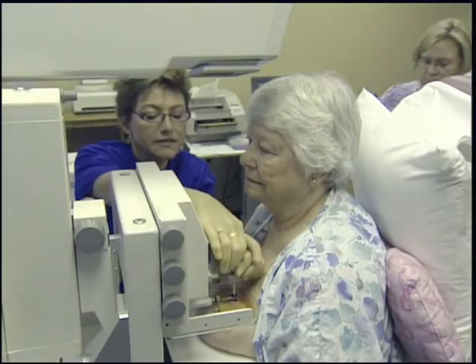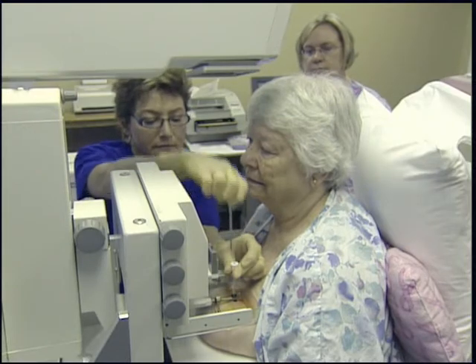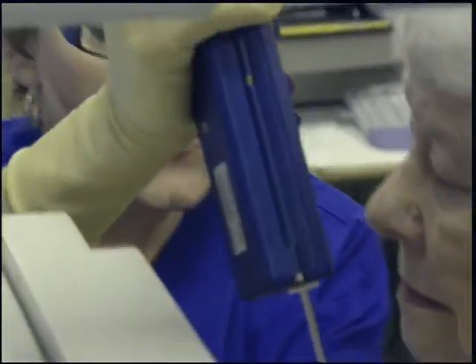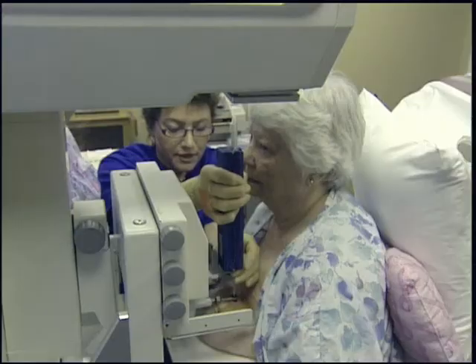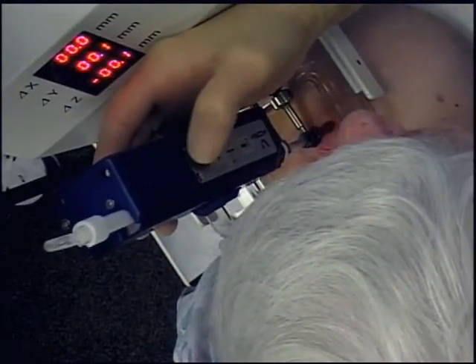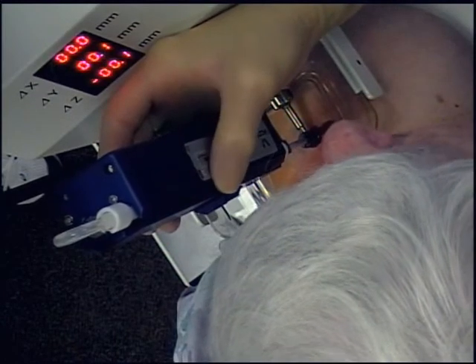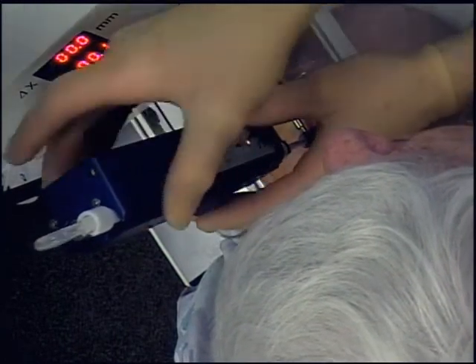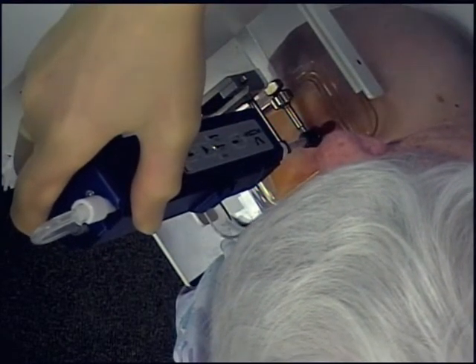Now I'm going to remove the stylet. We're going to start out with four samples. We're going to deploy this to the right depth and you're going to hear a pop and feel a little vibration. Now a little electric toothbrush sound as we complete the sampling.